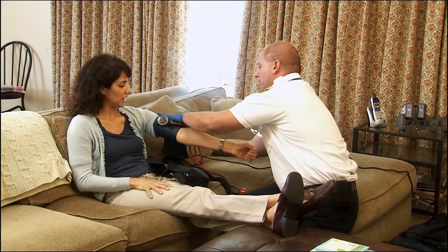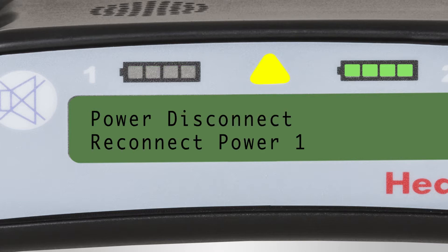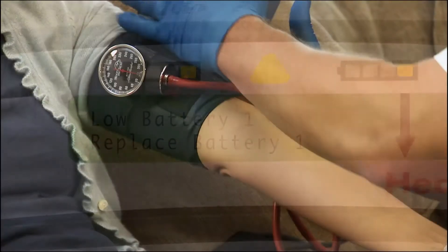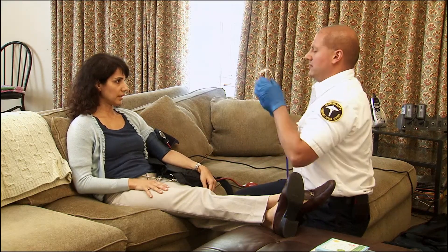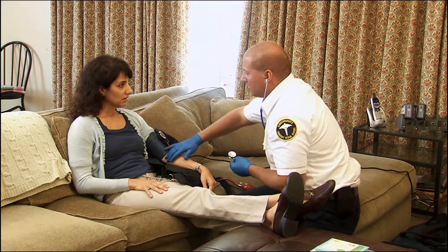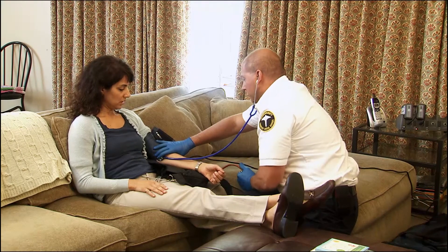If there is an issue with the pump, the display on the controller will provide two lines of text: the first line will indicate what the alarm is, and the second line will state what action should be taken. Don't be distracted by the pump — VAD patients can still experience other medical conditions like arrhythmia. If a patient has an arrhythmia, its effect may be different. Patients may be awake with or without symptoms from ventricular arrhythmias. Depending on your assessment, the VAD patient should be transported to their implanting center or to the closest hospital.